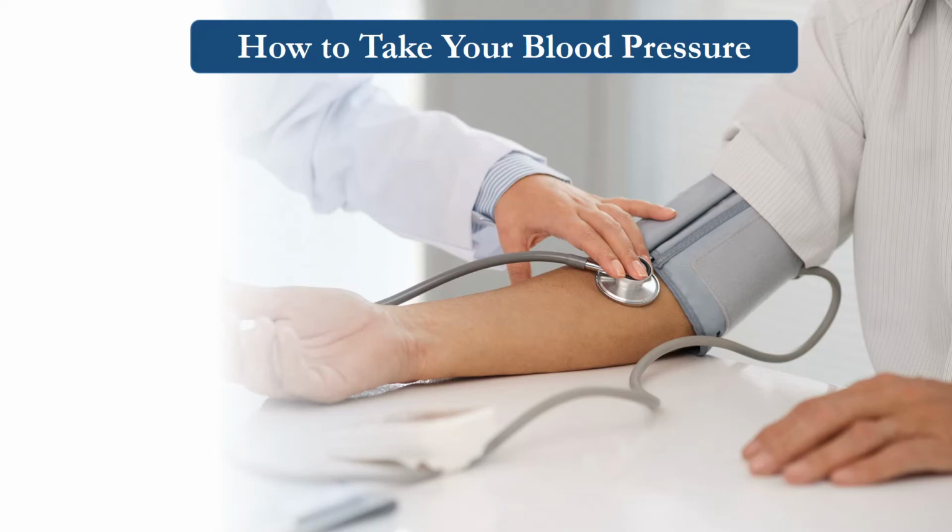The third step is the most important and the most difficult, and that is to sit and wait for 5 minutes before you take your blood pressure. The reason it is so important to wait is that blood pressure typically drops on average about 10 points or 10 millimeters of mercury after waiting. In some people, there can be an even bigger drop. The blood pressure you obtain after sitting for several minutes is the most accurate one.